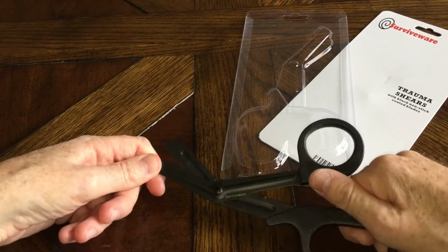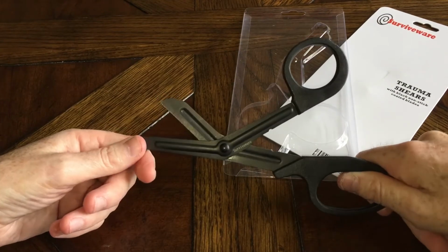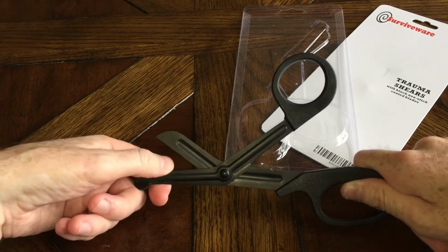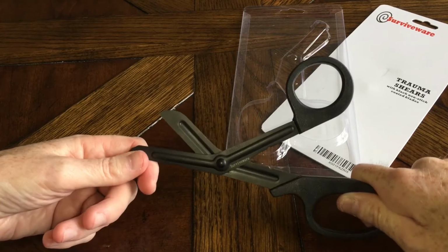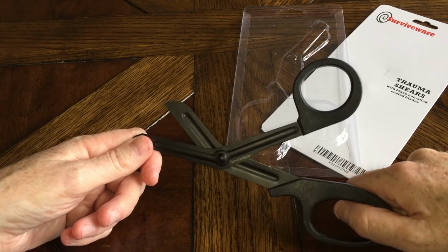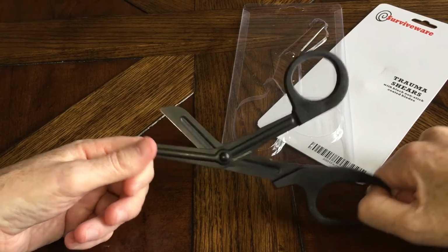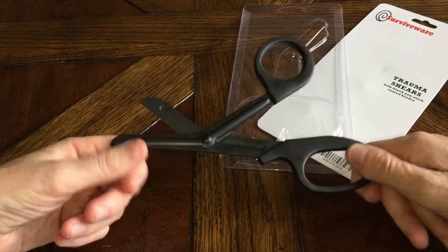They're a little big for my hands, but they're standard size. I know there are companies out there that make smaller, but you probably don't get quite the leverage. This side of the blade is serrated, and this other side is smooth. So it makes a good combination for cutting through fabric or various materials. You can see on the advertisement listing on Amazon that they're cutting through things like pencils. I haven't tried that, but I'm sure these would stand up to that.